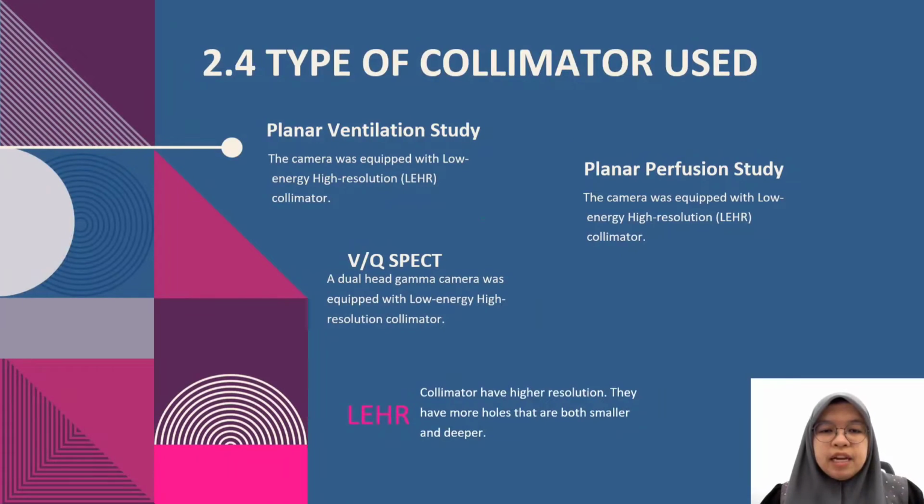For the planar ventilation study, the camera was equipped with this low energy high resolution collimator. Also for the planar perfusion study, the camera was equipped with the low energy high resolution LEHR collimator.